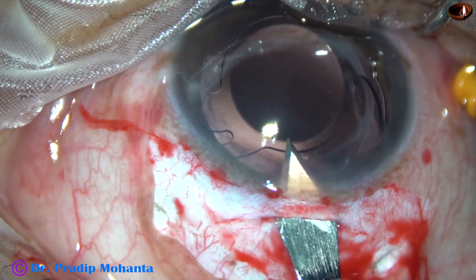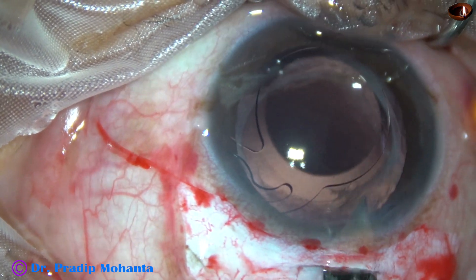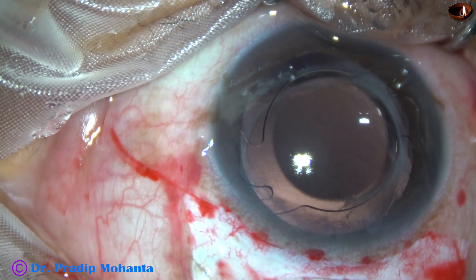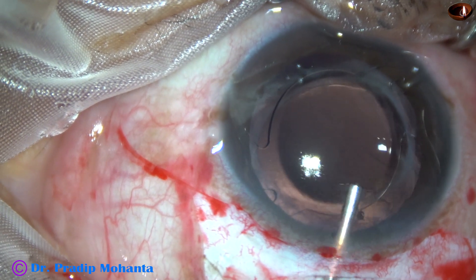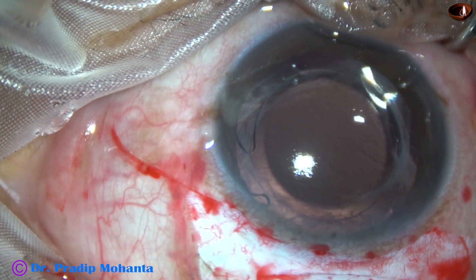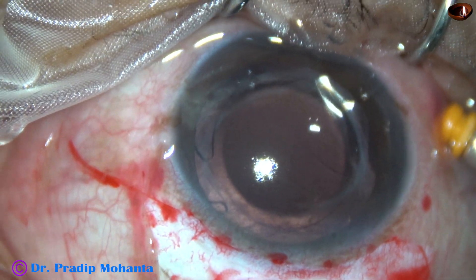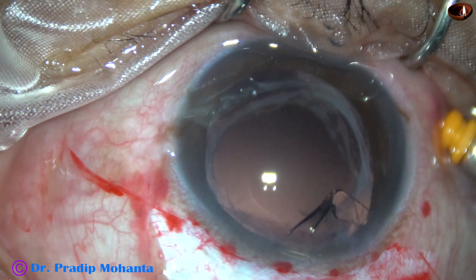Now I open the tunnel. The width of this tunnel is about 6 mm, so the lens will come out easily. I hold the lens. Before removing the lens, I stop irrigation, place viscoelastic, fill the anterior chamber with visco, then hold the lens with a stout McPherson's forceps and pull it out.